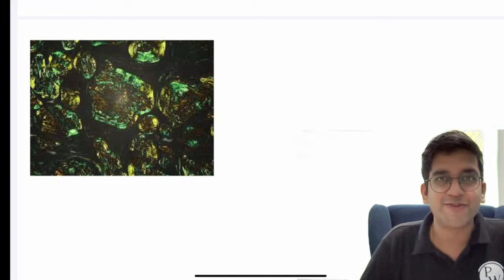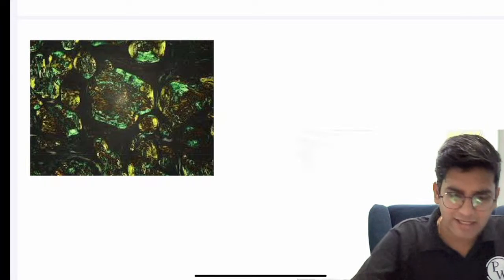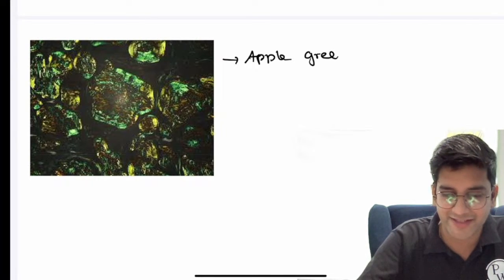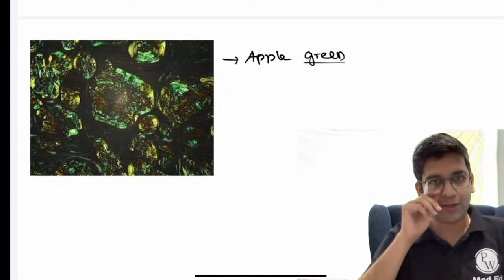I'm enjoying this. You guys are amazing, right? Spotter. That's a classical apple green birefringence, right? Who will not write this?